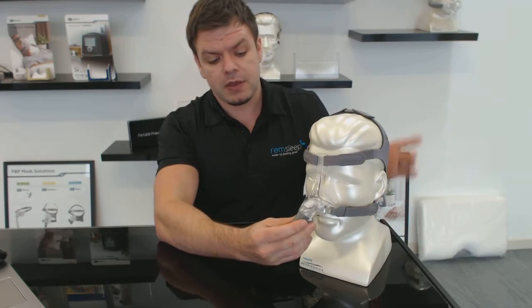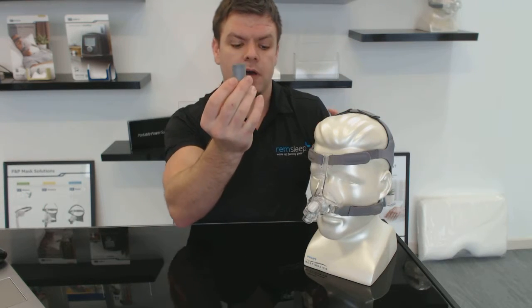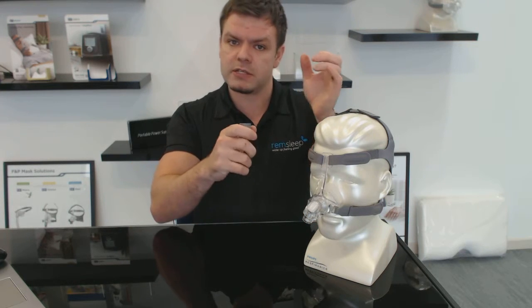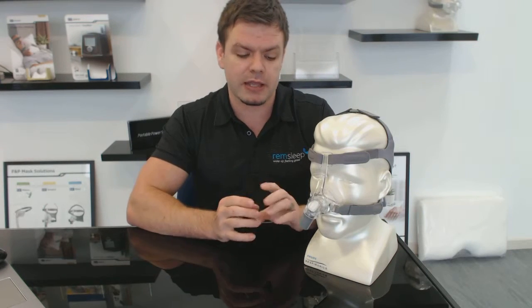This part of the mask is a quick release — it just pops off. The idea is that when you've got your tubing connected and you need to get up to go to the bathroom at night, you can stop your machine and just pull that off quickly, then click it back into place when you come back. Most masks have that these days, but it's certainly a good feature.